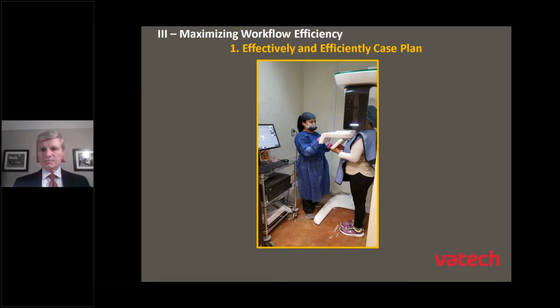As an example, when we're talking about image capture, one of the greatest things that we continue to focus on is image quality. Your time is best suited when you are working with clean data. Again, whether it be 2D or 3D, but certainly 3D data. Making sure that your team understands how essential it is to capture good data for you to work with.